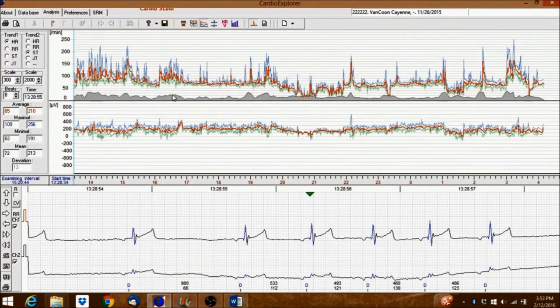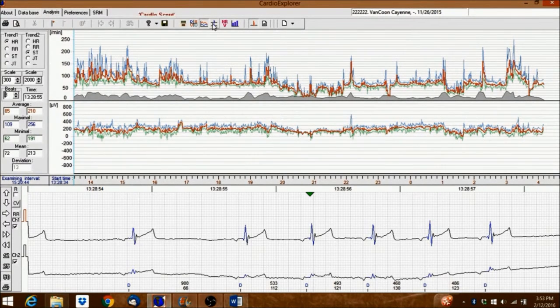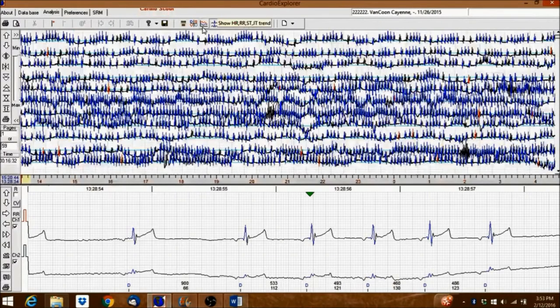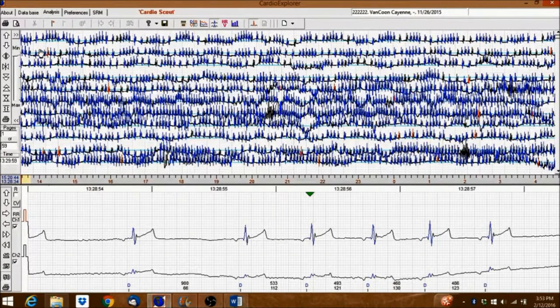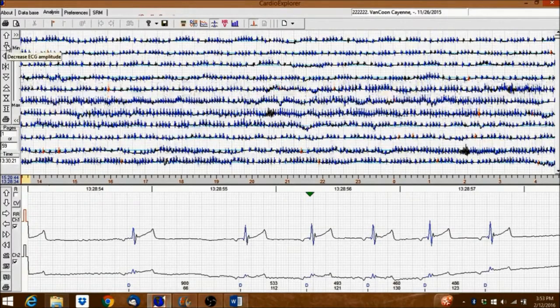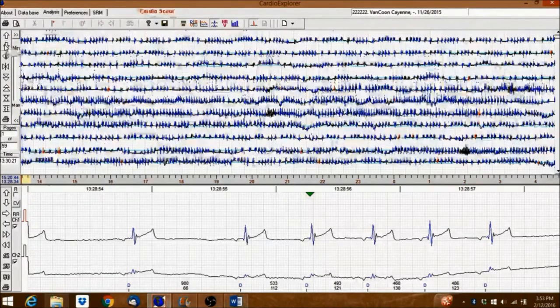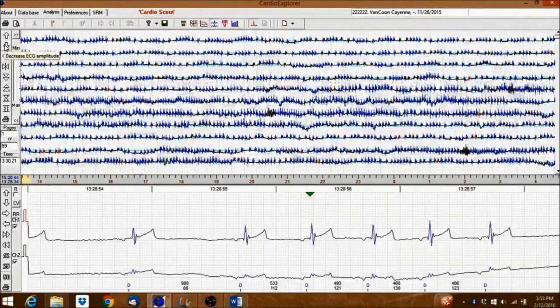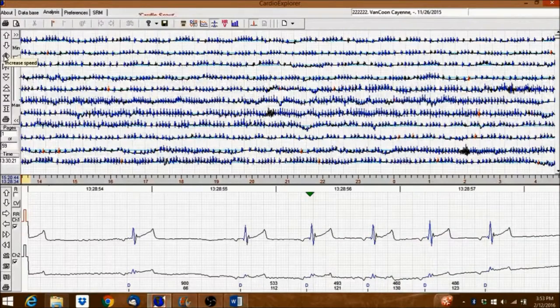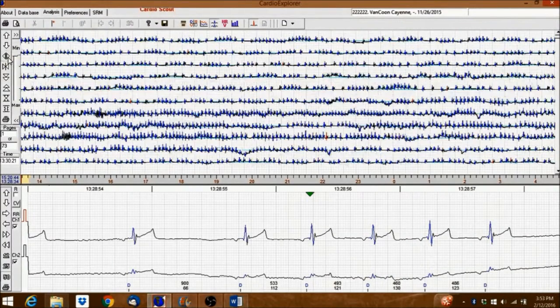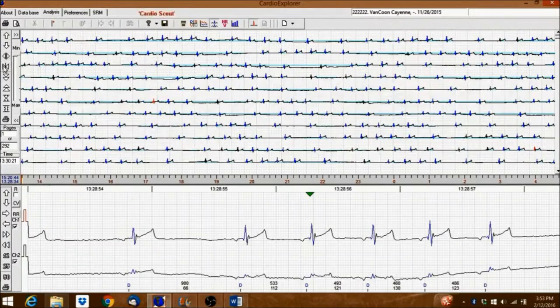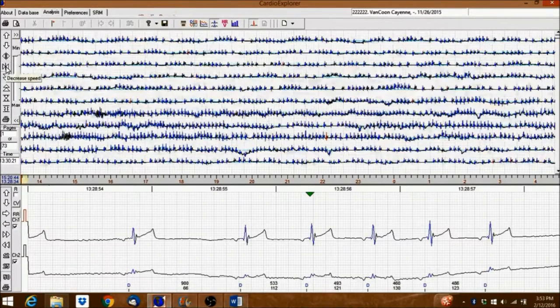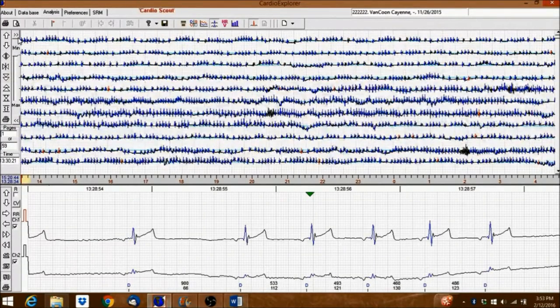Click on the Full Disclosure icon to show the entire recording at a glance. The up and down arrows adjust the amplitude. The left and right arrows increase and decrease the paper speed. And the up and down arrows scroll through the pages of the recording.